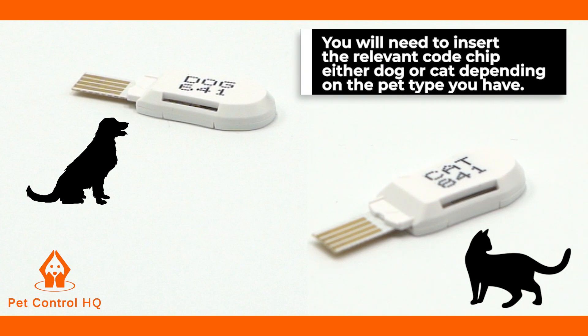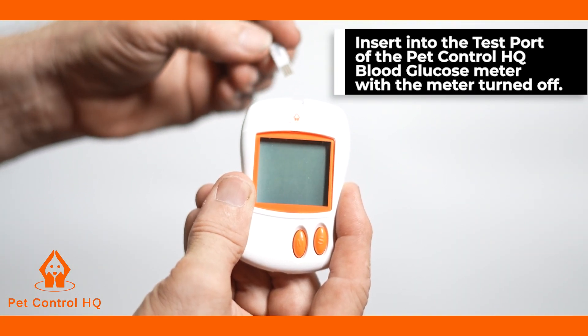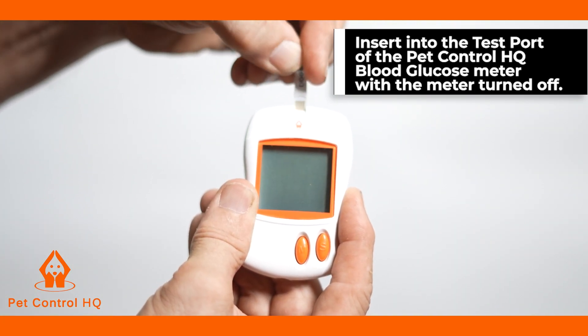You will need to insert the relevant code chip, either dog or cat, depending on the pet type you have, into the test port of the PetControl HQ blood glucose meter with the meter turned off.